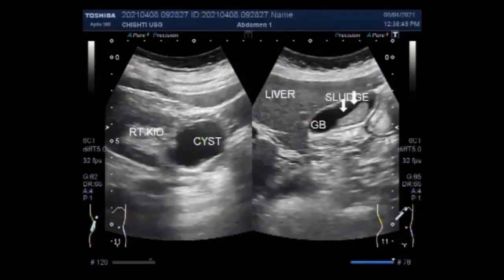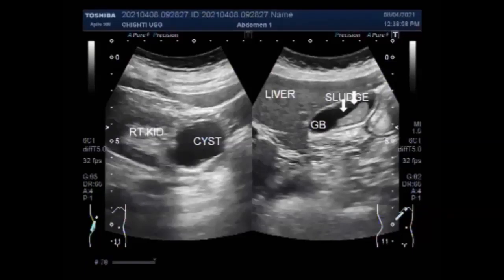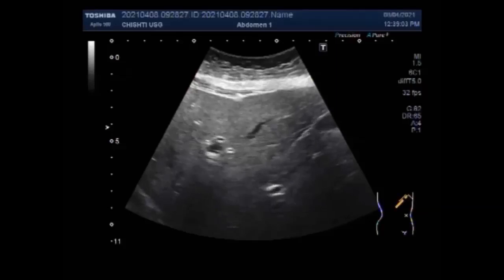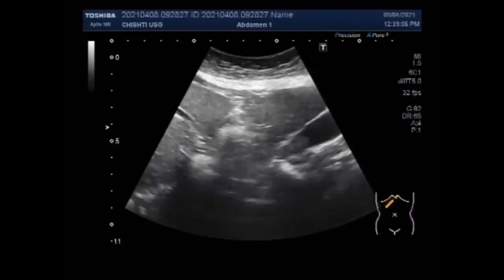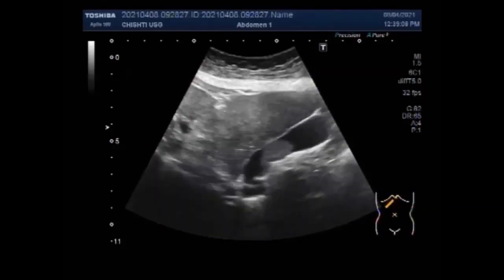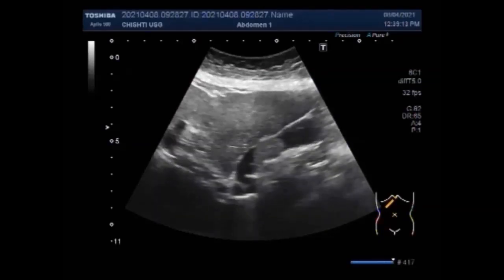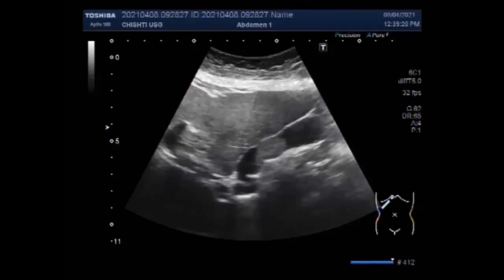Dear viewers, I hope you are all fine. This ultrasound video shows the difference between the gallbladder sludge ball and sludge. You will see the difference, causes, and symptoms of the gallbladder sludge and gallbladder sludge ball. You can see the gallbladder and it has a significant amount of thick sludge in its interior near the neck of the gallbladder.